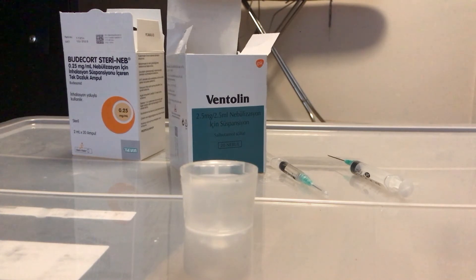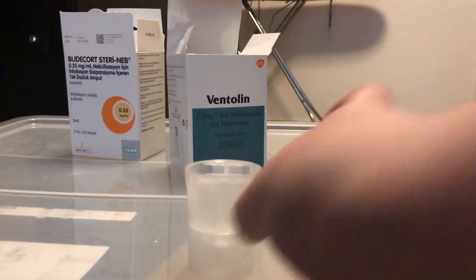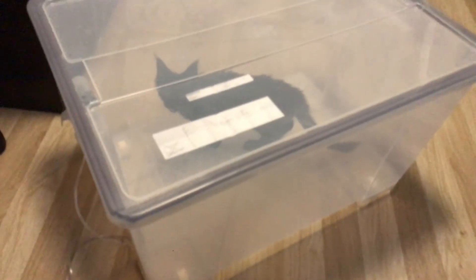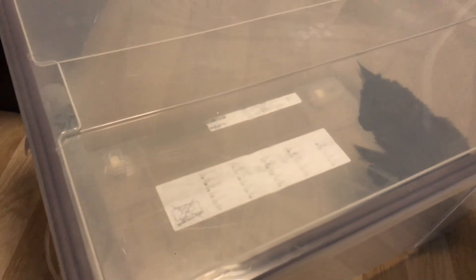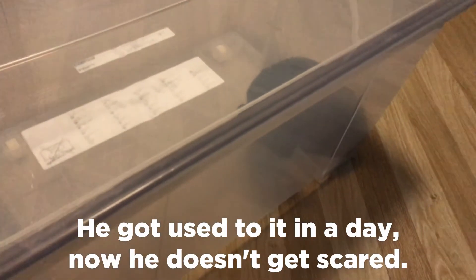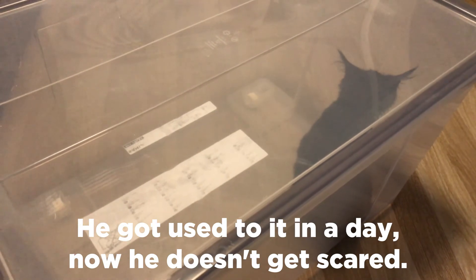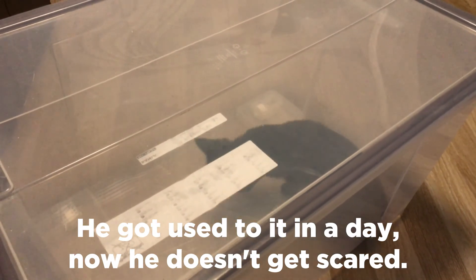It's all done, so I'll put this on, get kitty in here, and we will give it a test. Okay, the cat's in there, so let's not let it suffocate and let's start the machine. Obviously he hates this, but I'm not doing this to torture him — he obviously needs these meds. I don't know if you can see it on camera, but it is working just fine as I expected. It is very foggy in there.